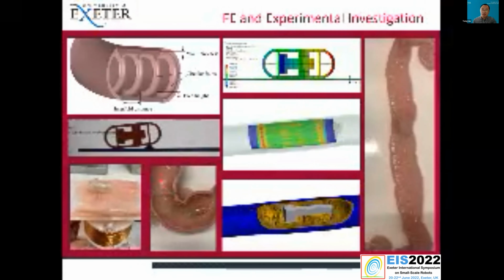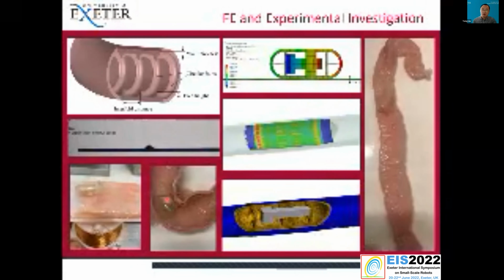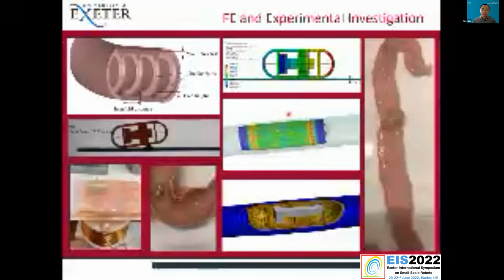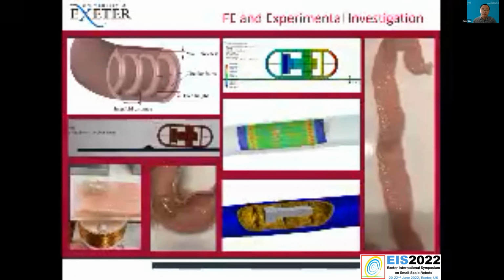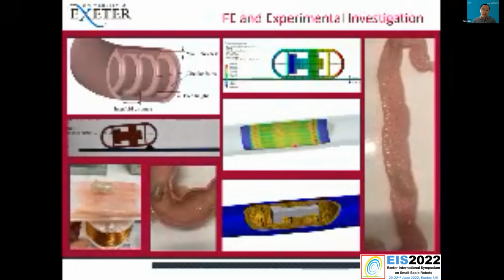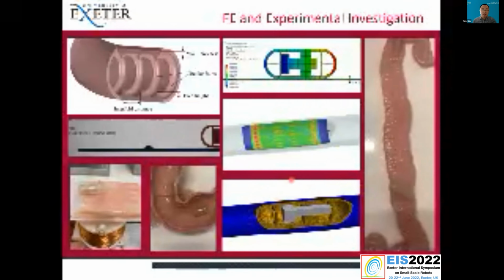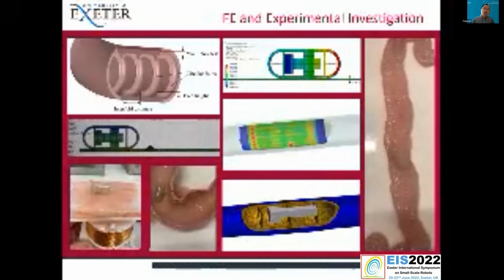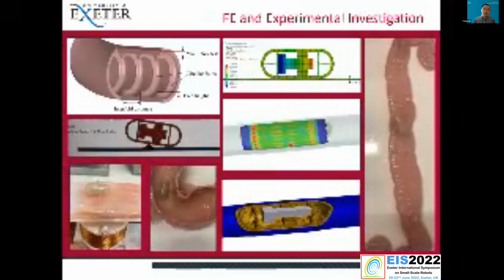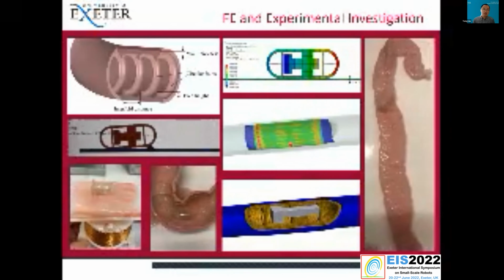Also in this case, we try to manipulate our capsule robots in a more complex intestine structure. Here we developed the finite element model to understand the contact pressure between the small intestine and the capsule when it's vibrating, and we try to reduce the force generated on the intestine in order to mitigate the influence on the patient.